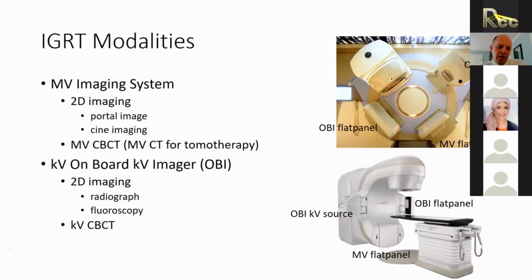There are lots of different ways that we can achieve image guidance and different technologies that are available. This includes megavoltage imaging systems. On the right here, you can see two different LINAC systems.